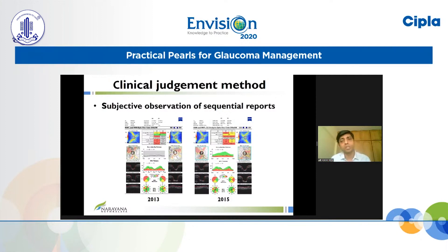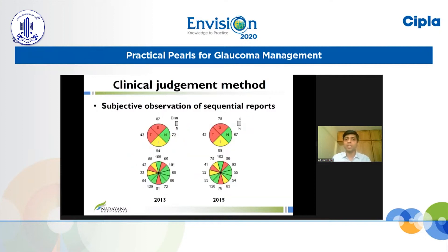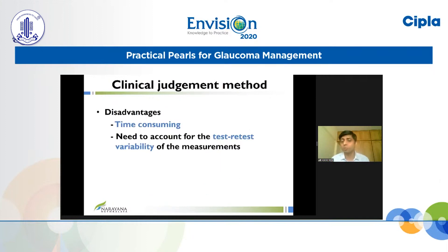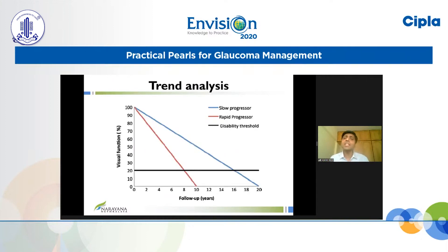The same subjectivity applies to the imaging method. Here are OCT reports — one done in 2013 and one in 2015 — and we can look at the RNFL thickness in the quadrants and clock-hour sections, noticing that the RNFL thickness in these smaller regions is reducing over time, both in the superior and inferior sectors. However, this is quite time-consuming and requires careful attention to smaller details. More importantly, we need to know the test-retest variability of these measurements. That is the reason we now have more analytical methods to detect progression.